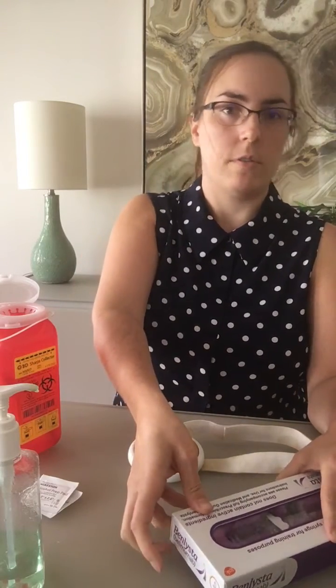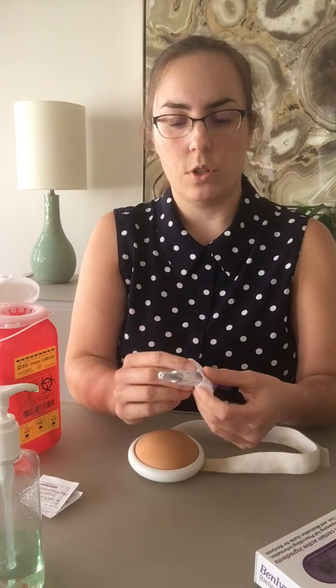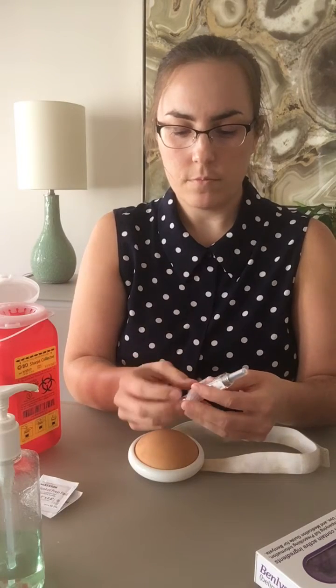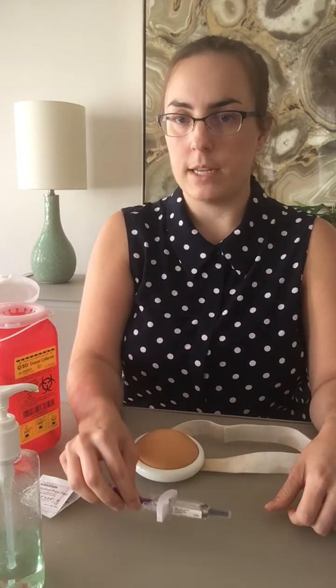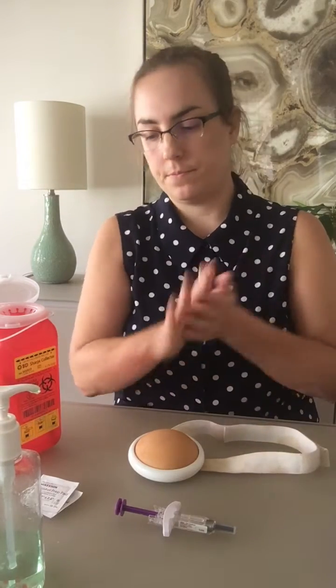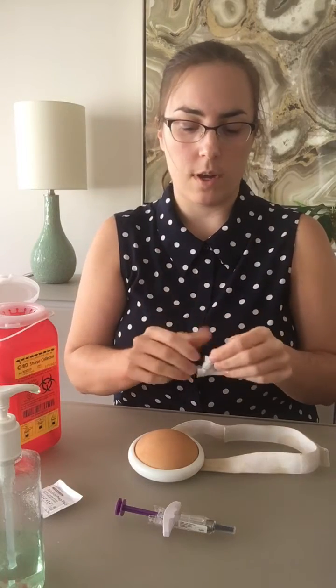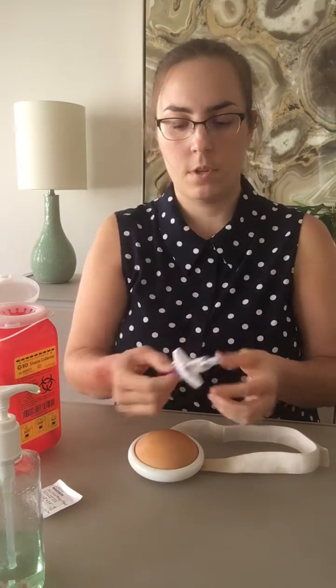Now let's do a pre-filled syringe. Most of the steps are the same. You want to take your medication, make sure that it's not expired and that it hasn't been tampered with. Again, it's going to look yellow to clear. There may be an air bubble or two — that's normal. You want to let it thaw for about 30 minutes. Wash your hands. The injection site is about the same. Take an alcohol swab and clean the area.